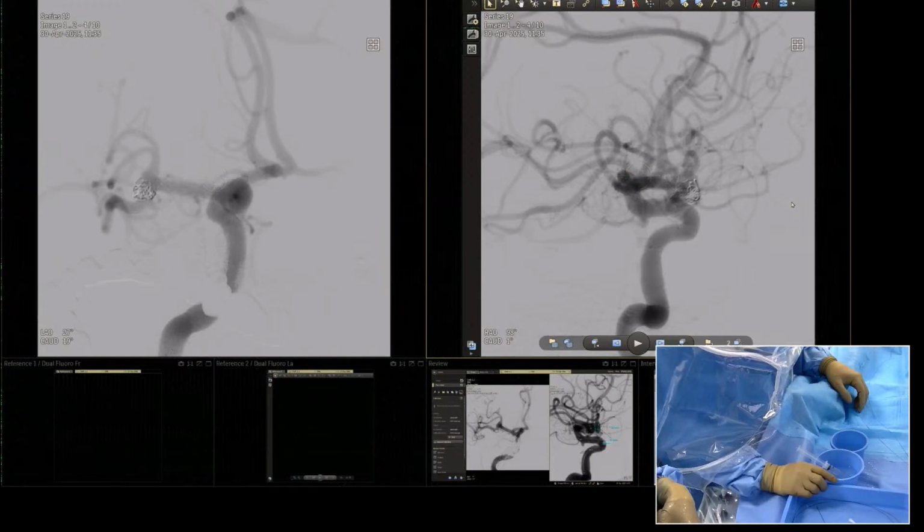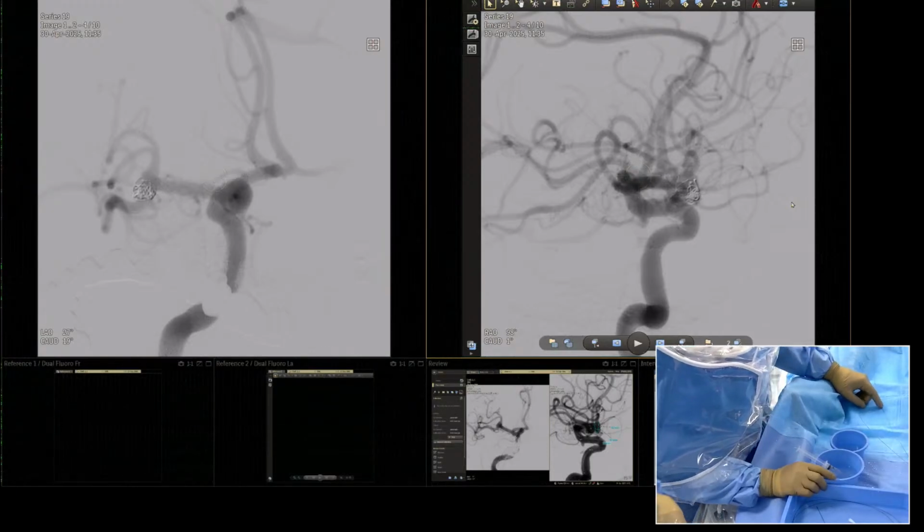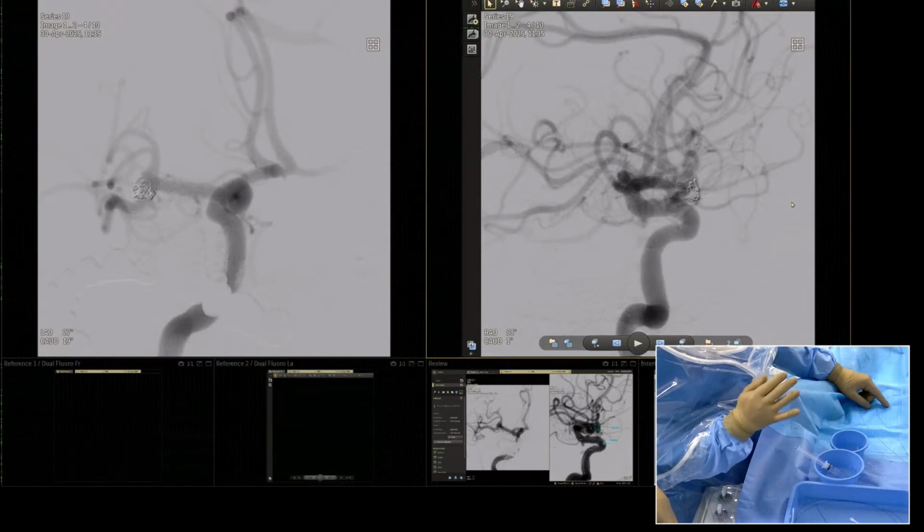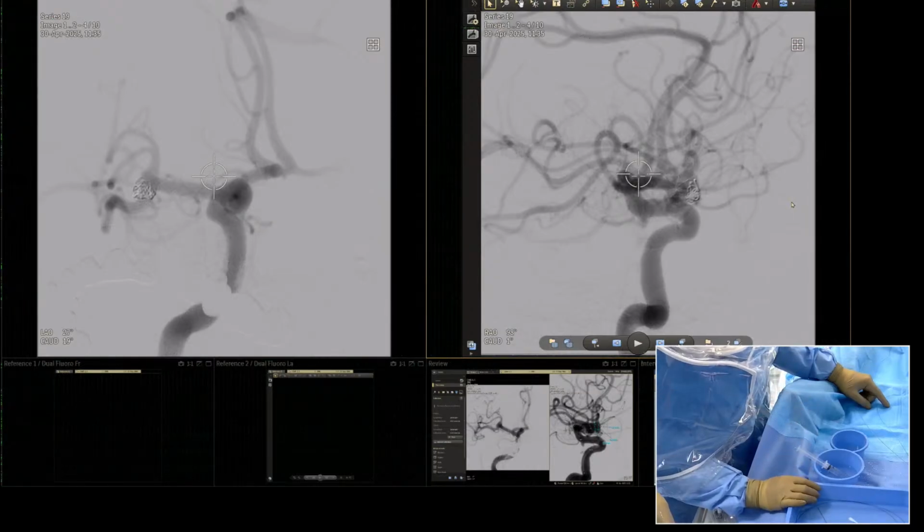Okay, let's see. Maybe the flow diverter like effect of Leo Baby will work, and for the left MCA territory we will call this patient in 3 months. And in 3 months I hope it will change, and then we can decide, and the stent will be opposed to the wall. Then manipulation inside the stent will be much safer.